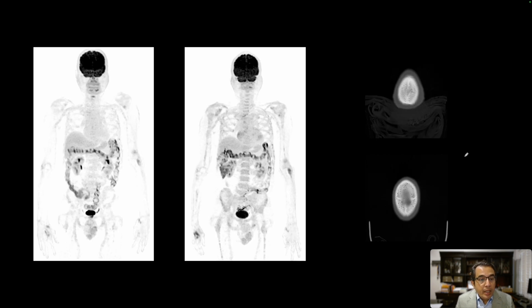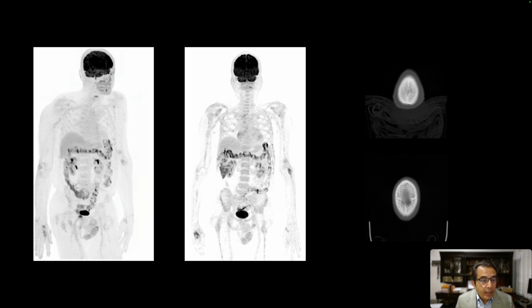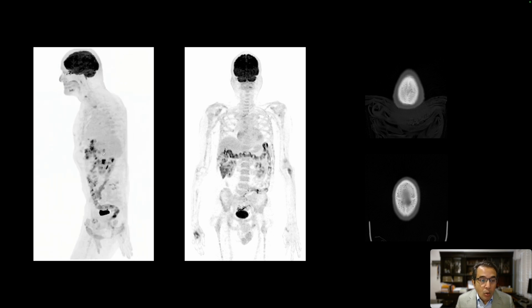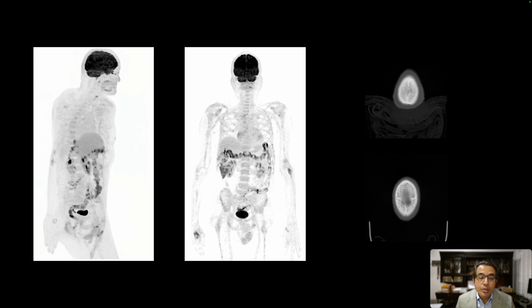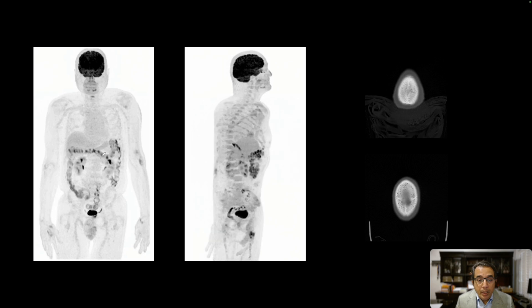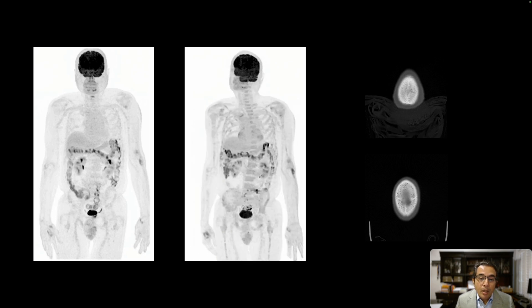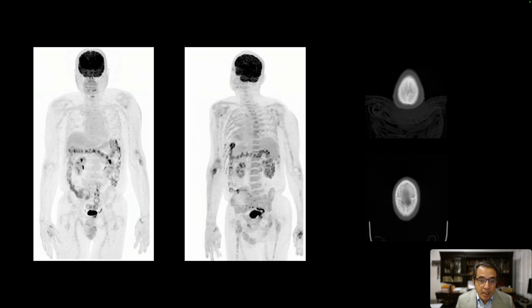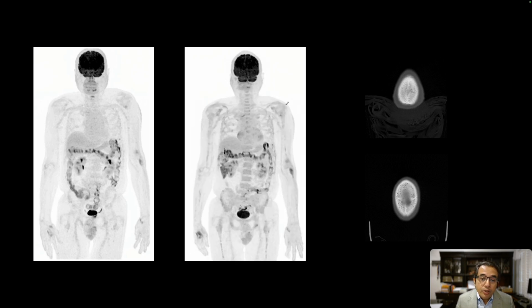Here is our next patient. They have a history of known multiple myeloma. Their prior PET-CT, the leftmost rotating image, was reported as negative — no hypermetabolic bone lesions or soft tissue lesions. They presented for follow-up because blood tests suggested multiple myeloma recurrence. On this FDG PET-CT study, compared to the prior, there is subtle mild increased uptake in the axial skeleton, and biopsy confirmed recurrent myeloma.